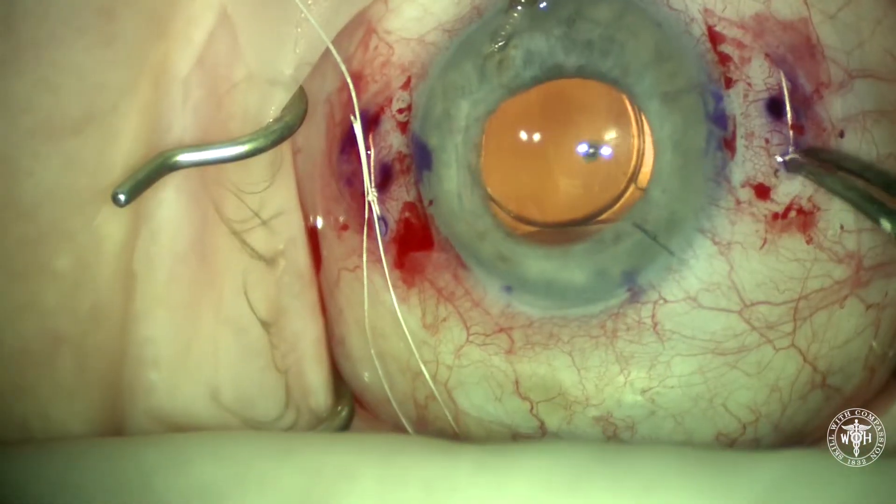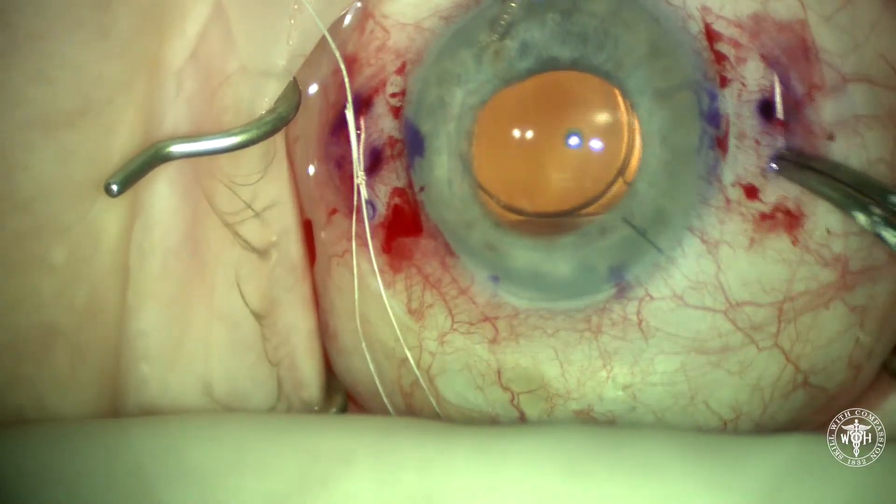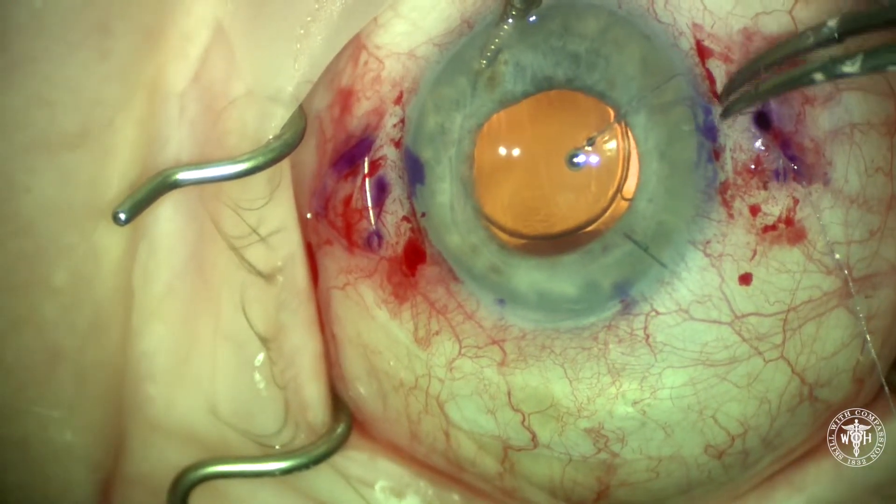Once you have your centration, I finish tying my knots, then cut the knot ends short, and bury the knot into the more proximal sclerotomy where the trocar used to be.